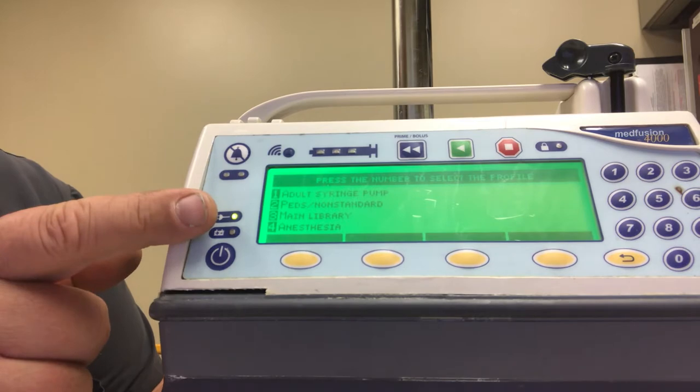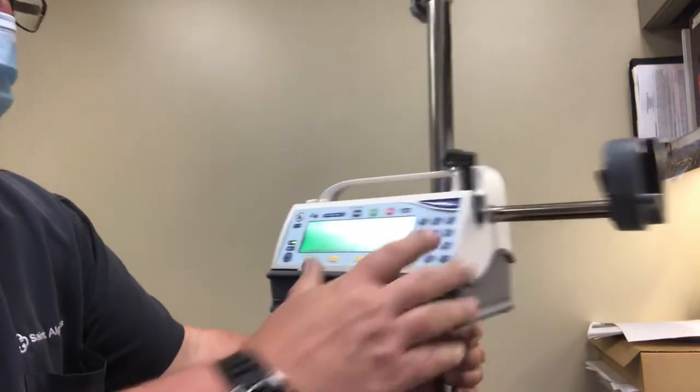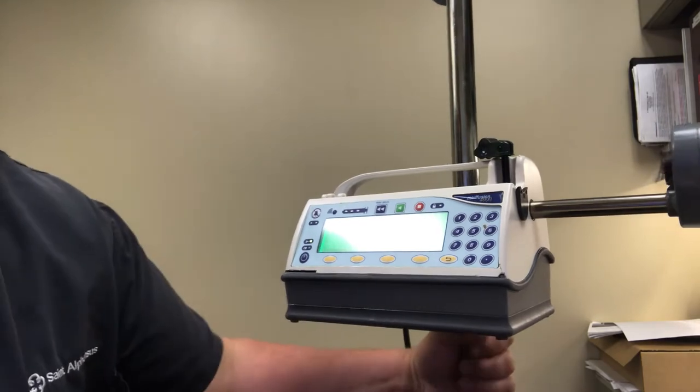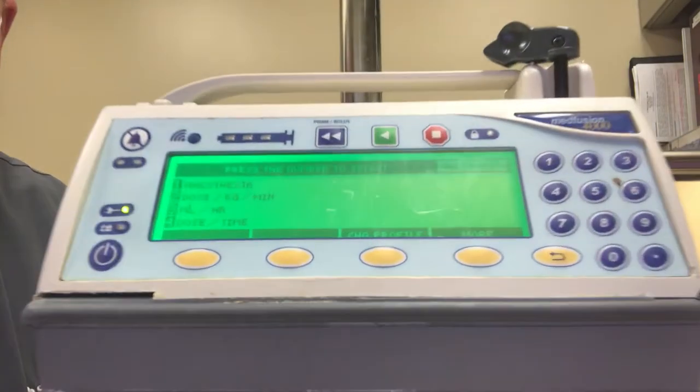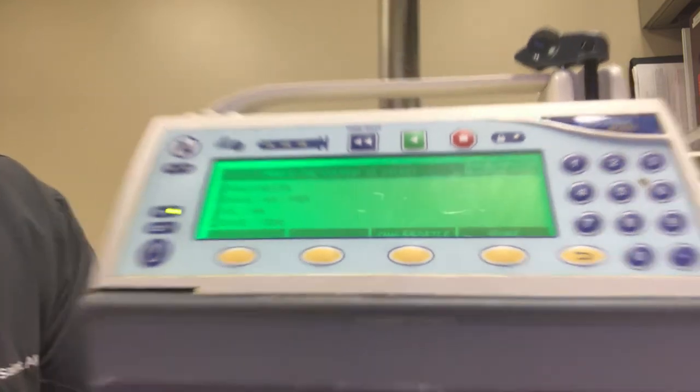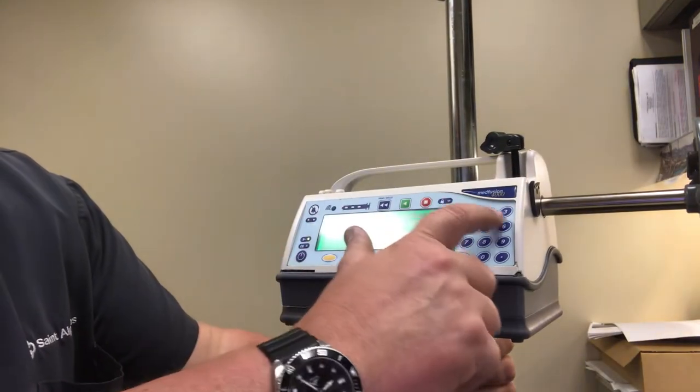And you're going to pick the fourth one where it says anesthesia, then it's going to ask you mils per hour, dose rate, so you're going to pick mils per hour which is option number three.